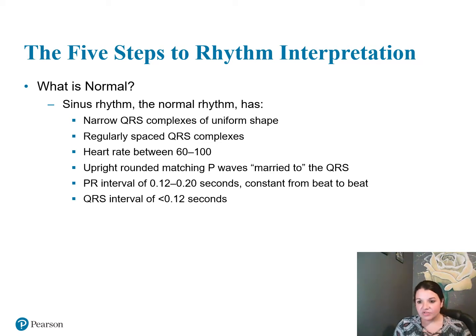If we were in class right now, you would be in gray scrubs. We would be in uniform. Everybody would know you were part of the patient care tech program, and that you were in a medical class, and you were in uniform. So when they say my QRSs need to be narrow, all of my QRSs need to be narrow. I can't just have one narrow and then a wide and then a narrow, then a wide, and so forth. Everybody needs to be uniform.